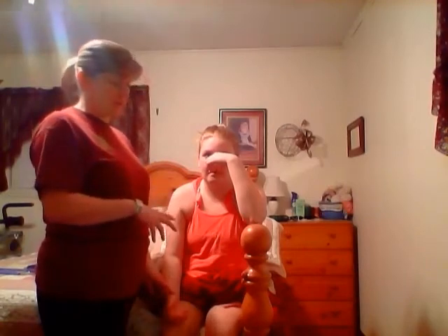Of course, if there's any defects noticed while you are listening to the heart, you'd want to palpate the radial artery. You can obtain the pulse by a few different ways. While you're obtaining it radially, you can look for 10 seconds and multiply by 6, 15 seconds, multiply by 4. You can just count it for a full minute. Pulse is 70 at this time.